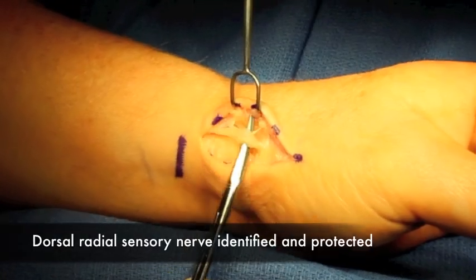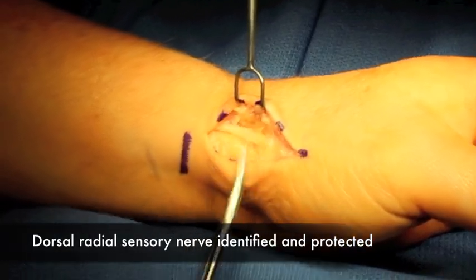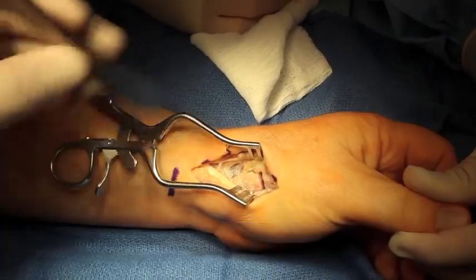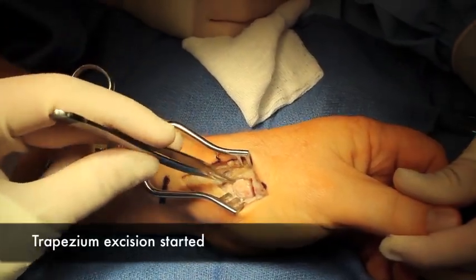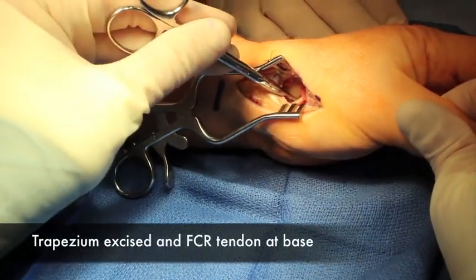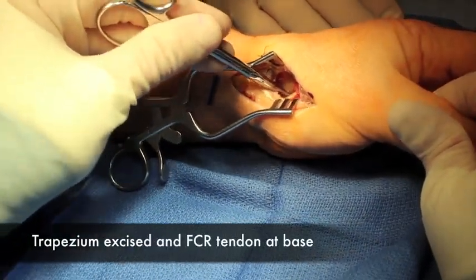The dissection is carried down and the superficial branch of the radial nerve is identified and protected. The radial artery is identified, the joint capsule is incised, and the trapezium is dissected around. The trapezium has been removed with a rongeur and the FCR is at the base.